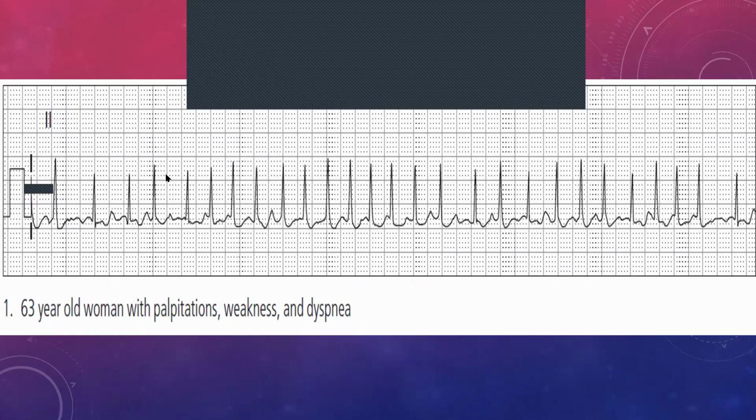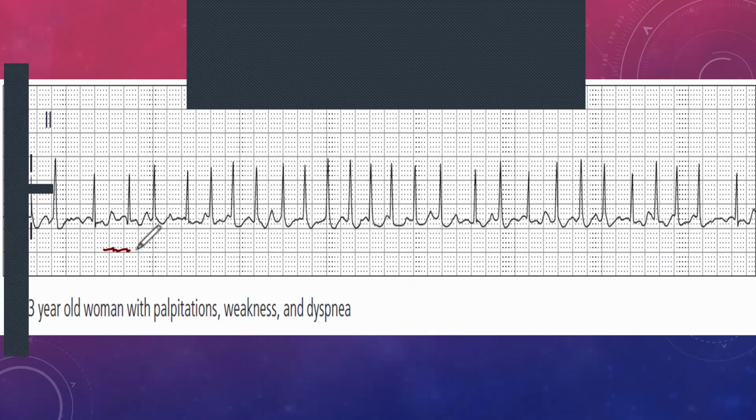And in slower AFib, it's much easier to make out what it looks like. So what happens is that in slow AFib, you'd get this sort of a fibrillation line, all right? And then you'd get your QRS complex, and then you'd have maybe 4 or 5 blocks, and then you'd get another one again.